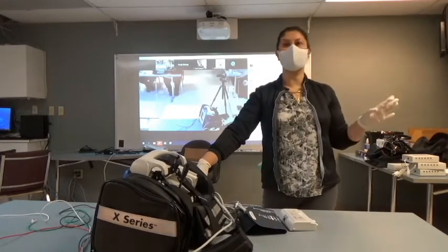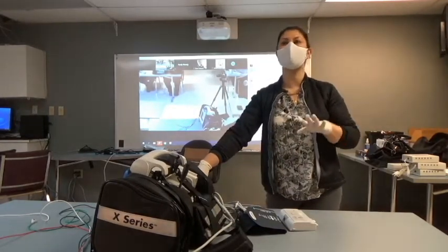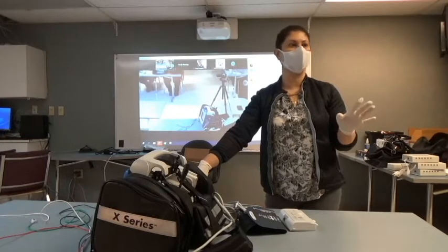Beneath that, there is a little port. You won't have to touch it. You won't have to do anything with it. It's simply the exhaust system to the capnography. That's all that it is.